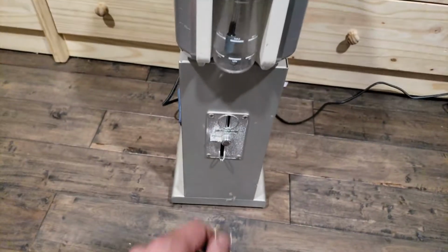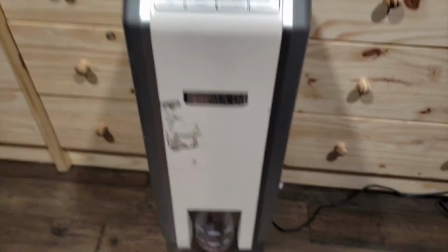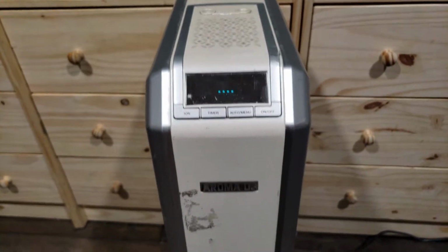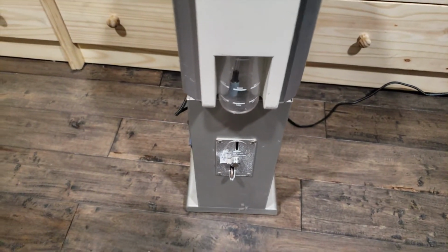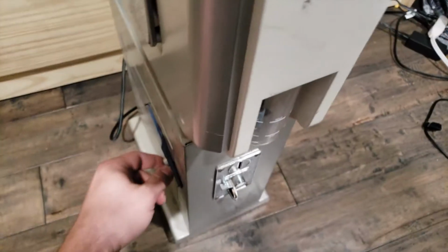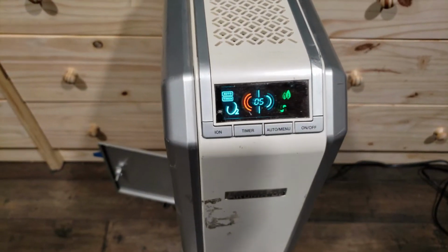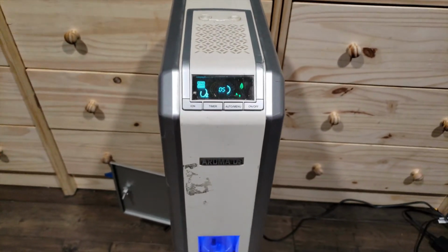It comes with a little coin slot. You put the coin in, and apparently nothing happens. Let's see if we can do the switch. Nope. Let's try it again. It doesn't like the quarter. Let's see if we can turn it on manually. There you go. And it gives you 5 minutes per coin, and it starts making noises.